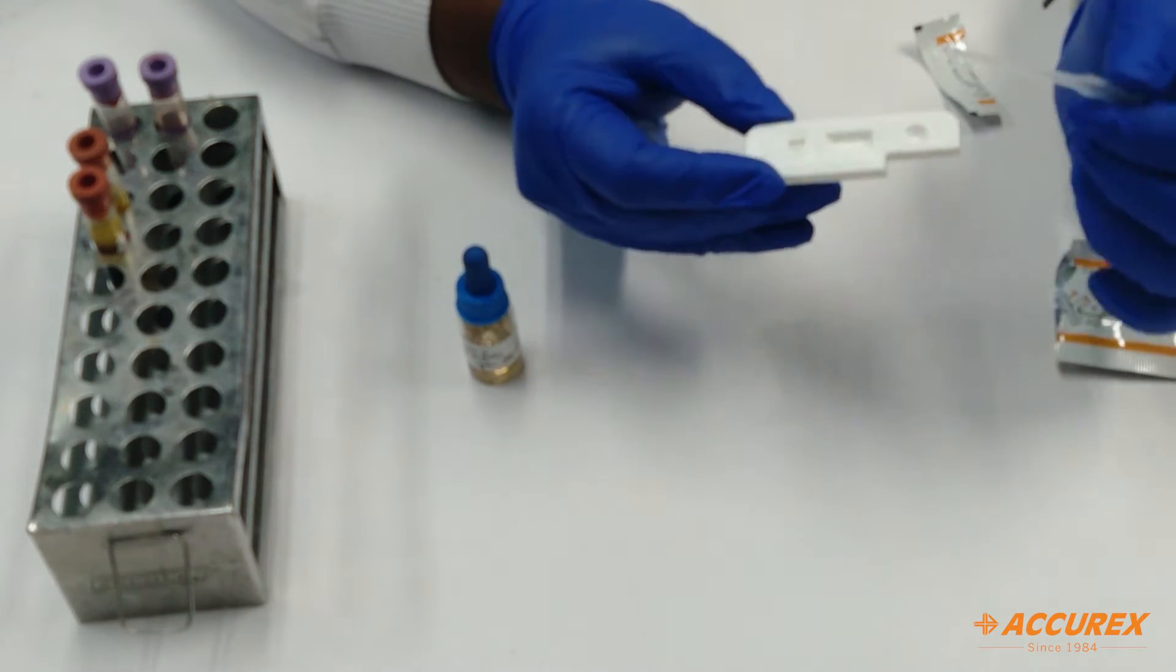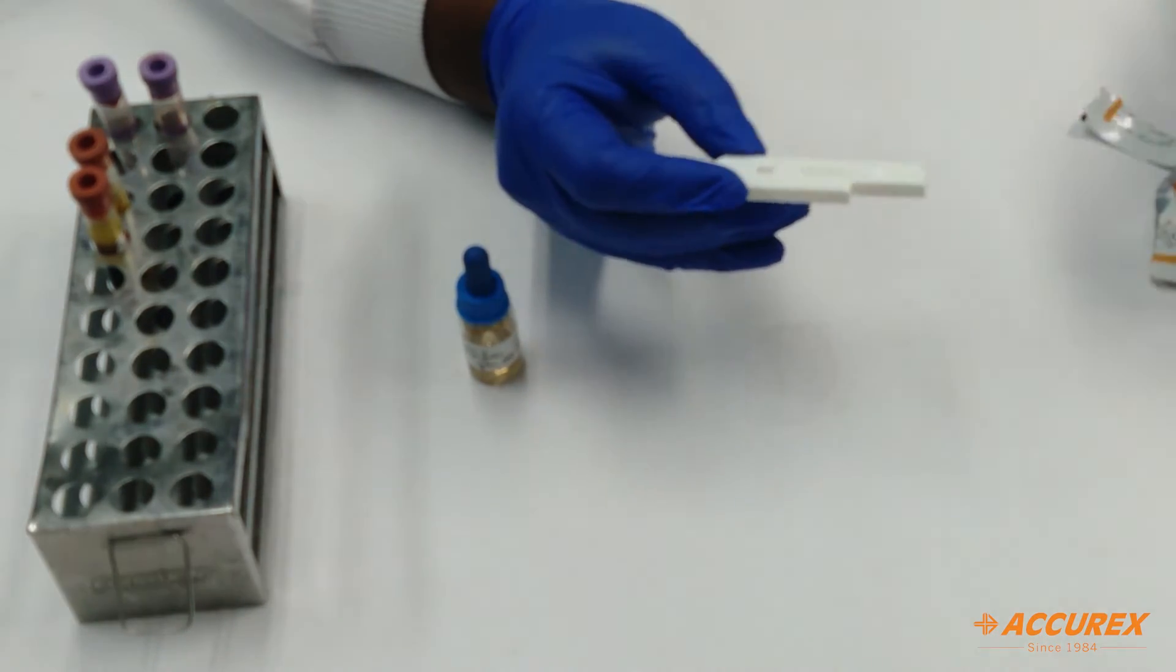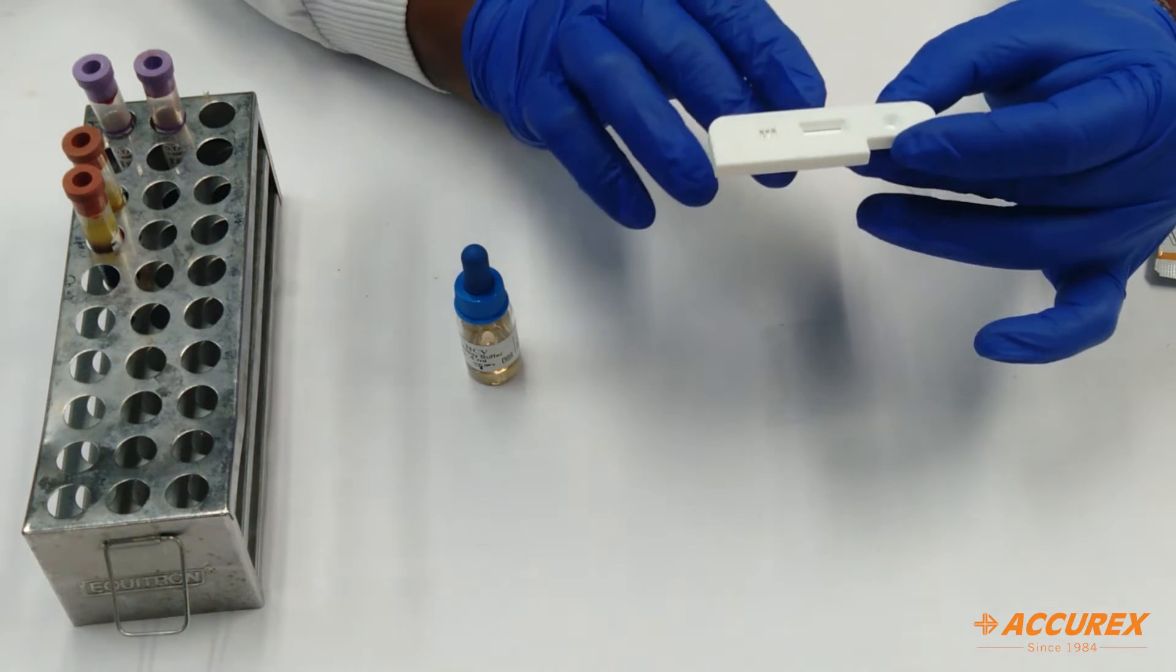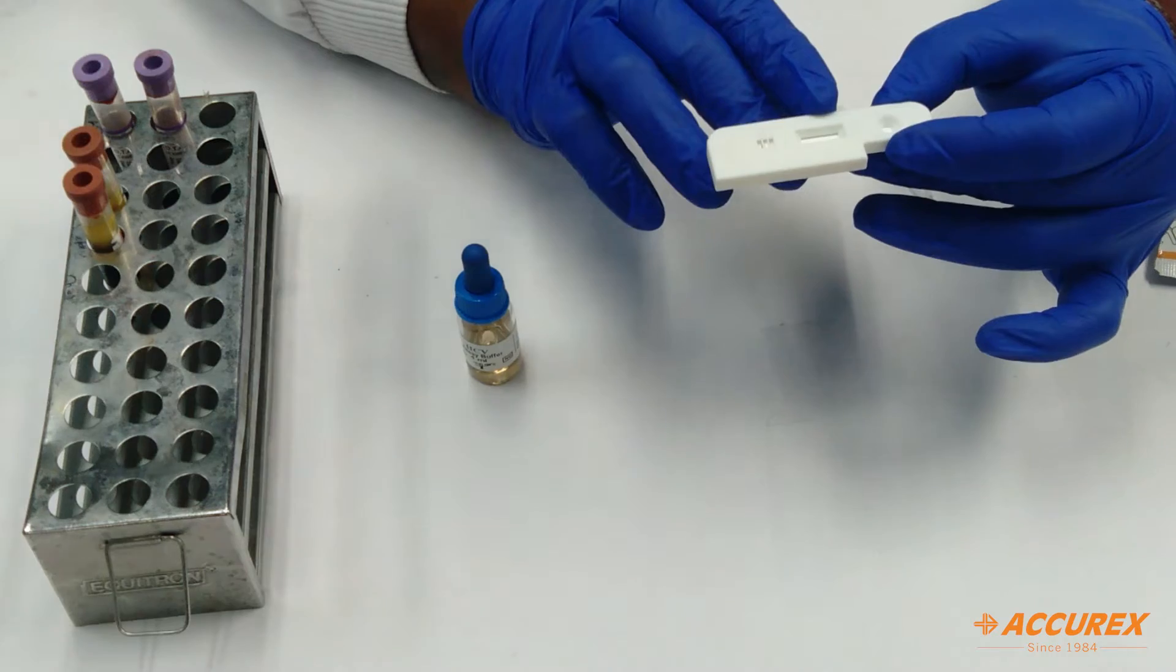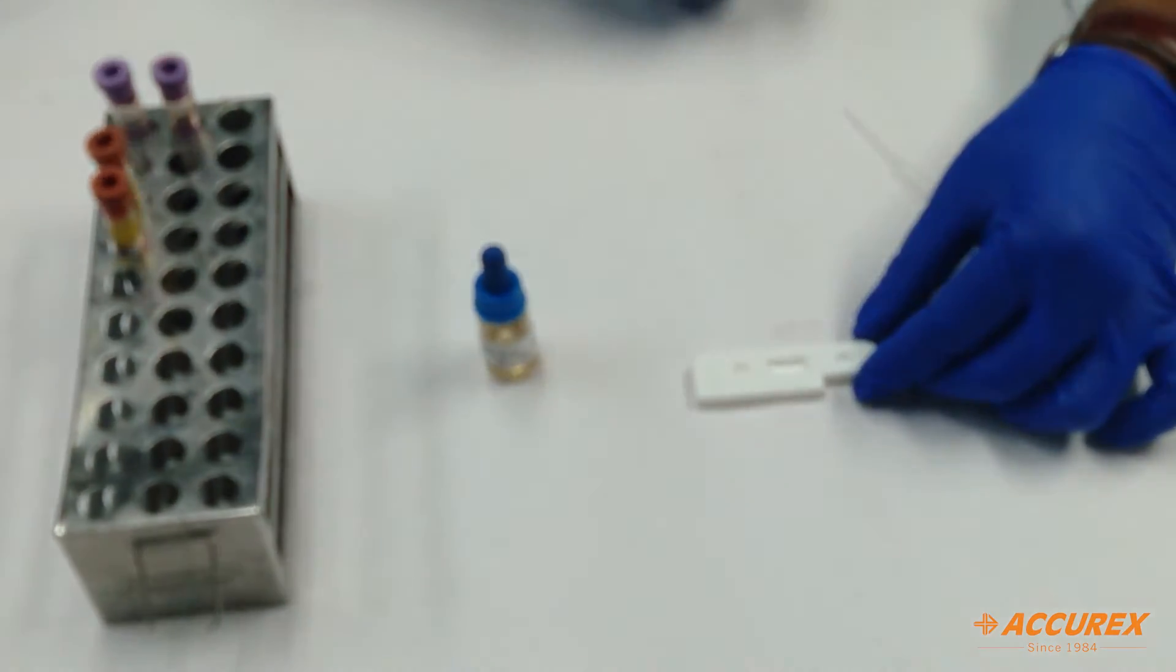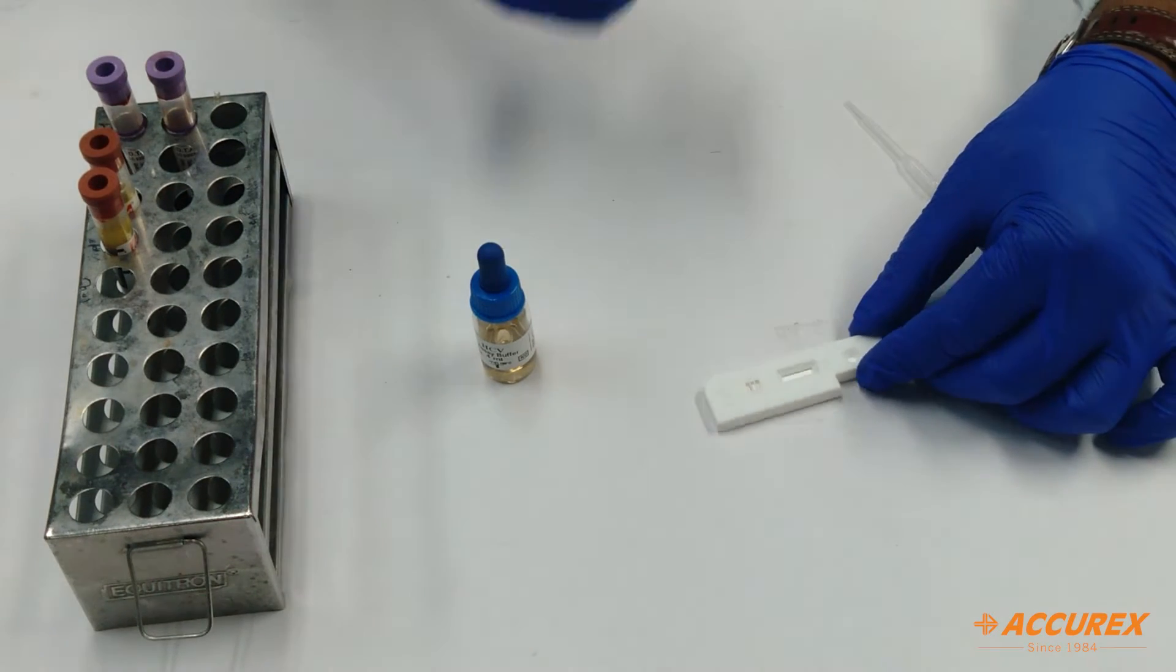On the test card you can see there are two holes. One is for the sample and buffer, the second window is for test results. One side is the test line, the other is the control line. Before testing, you need to write the name of the patient on the card.